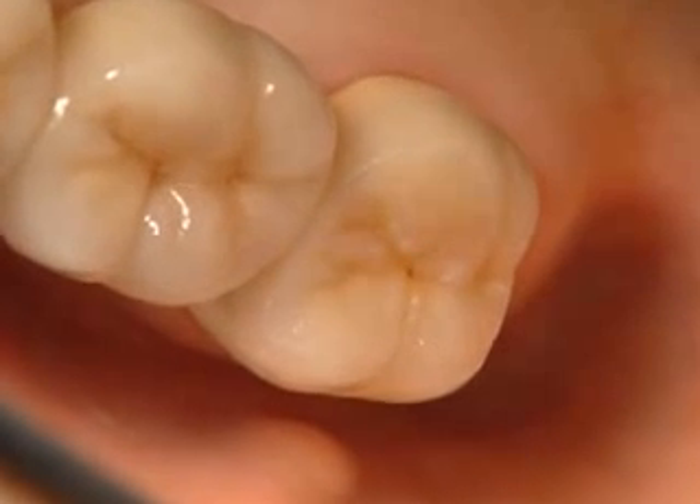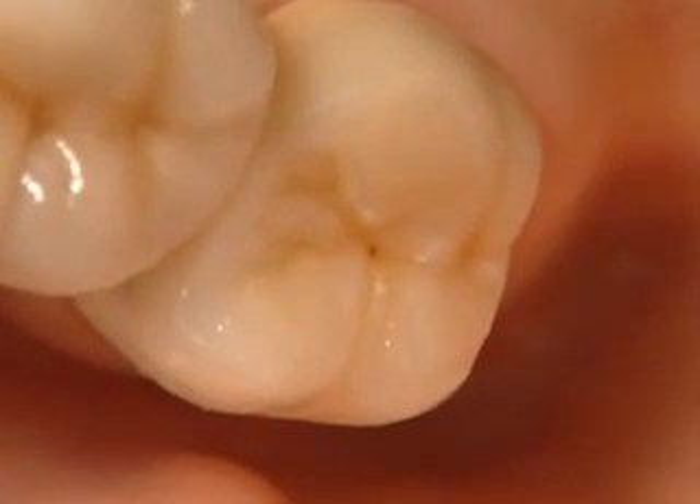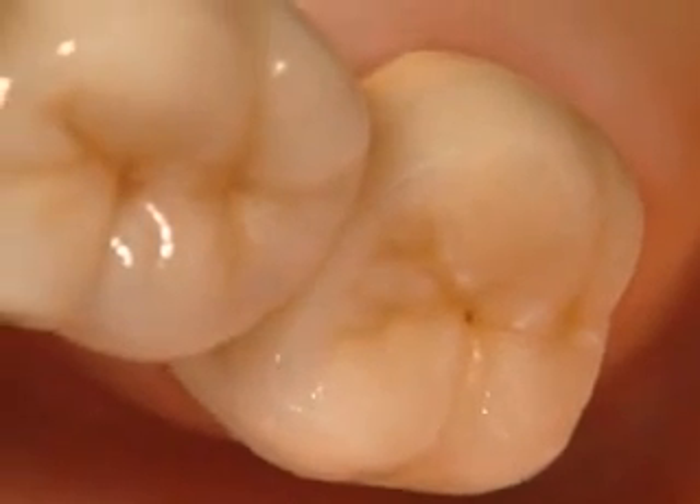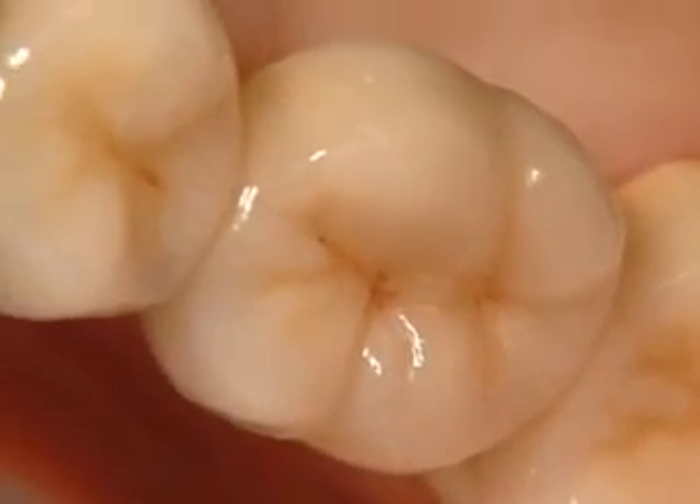Procera Zirconia bridges — ultimate stability, biocompatibility and durability. Procera Zirconia bridges.